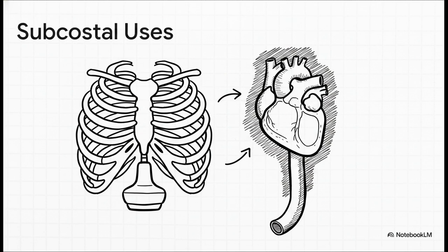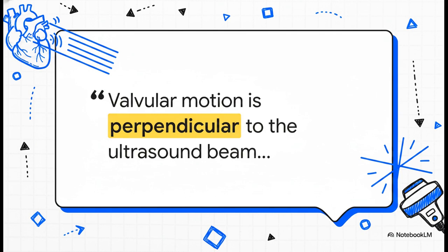Because of the unique angle, it's also incredibly accurate for measuring your right ventricular free wall thickness. And as a huge bonus, you use this exact same window to evaluate the great vessels in the abdomen, specifically looking at the inferior vena cava to assess your patient's volume status and right atrial pressures. Now, let's do a really quick clinical pearls and exam tips recap before we finish.